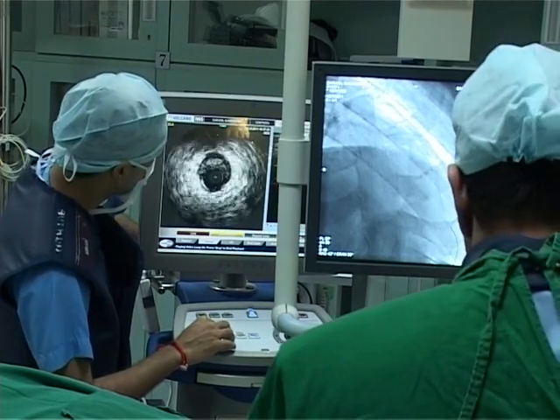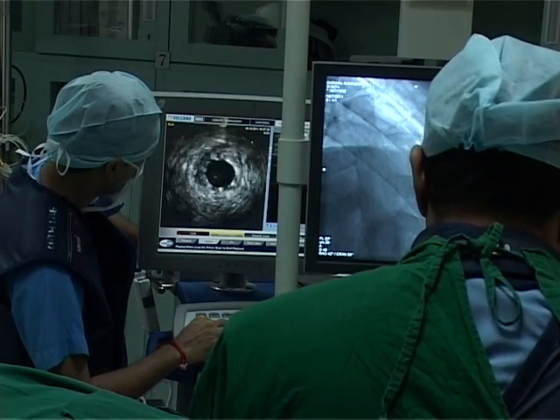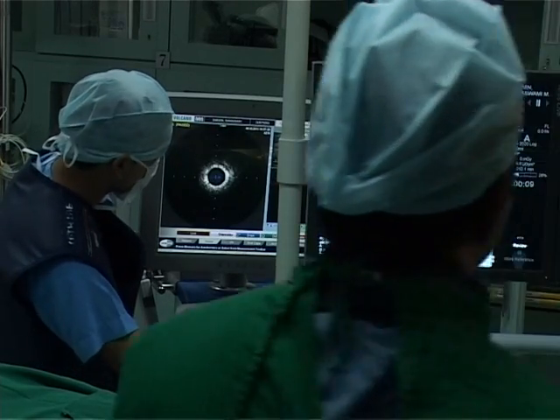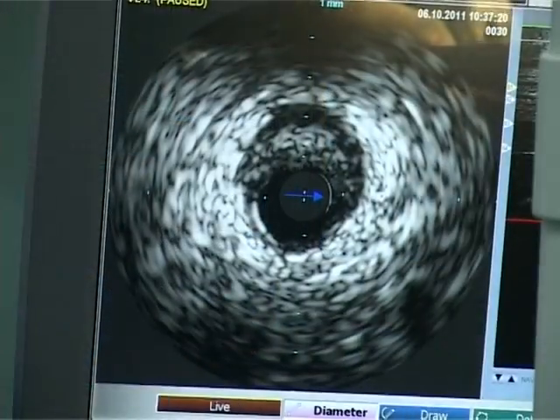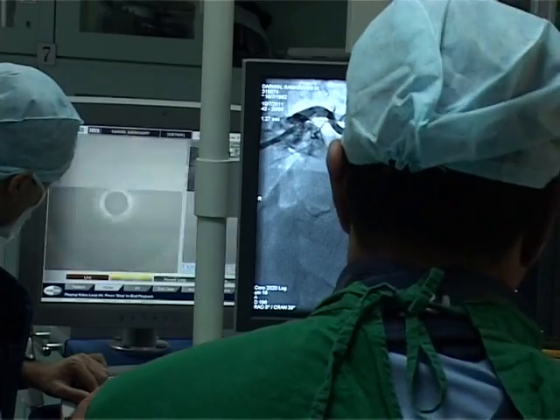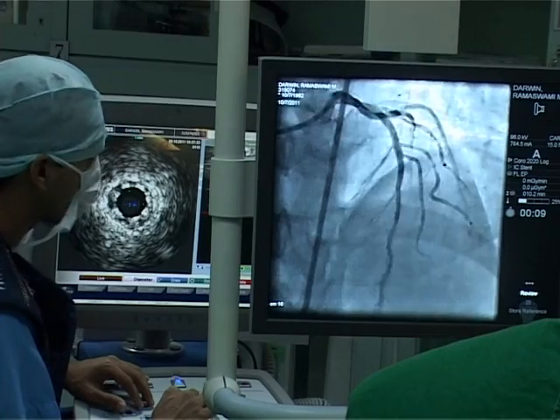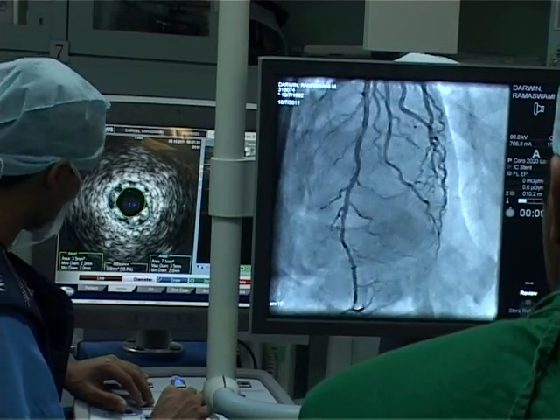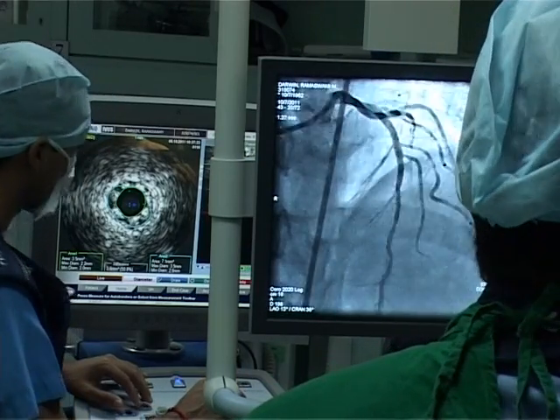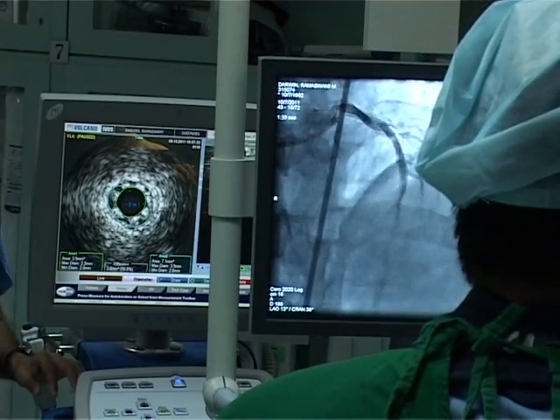Even on the coronary angiogram screening, you can see the angiogram looks perfect in terms of stent deployment. This is a final image to show the struts of the stent extremely well opposed on the arterial wall on a pullback. This image is post-stent deployment, and you can see the stent well opposed on the arterial wall, and you can also see a chromaflo with the color flow mapping, which shows a very widely open lumen of the coronary artery.